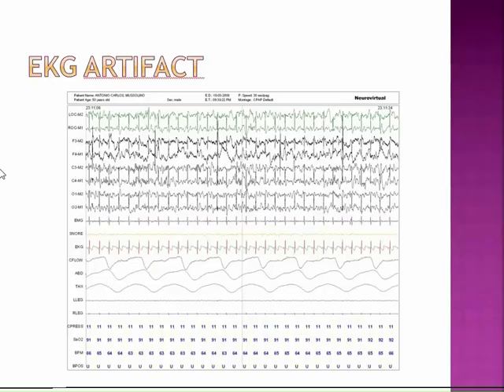If you don't go high enough behind the ear on that bone, and you're more on a softer area behind the ear, you can cause that kind of pulse beat to be felt and picked up by the M's. And so the correct way to try to fix this would be to go in and move the location of your M's. Move them up a little bit higher. Make sure they're really on the pointiest and hardest part of the bone that you can get the M's on.